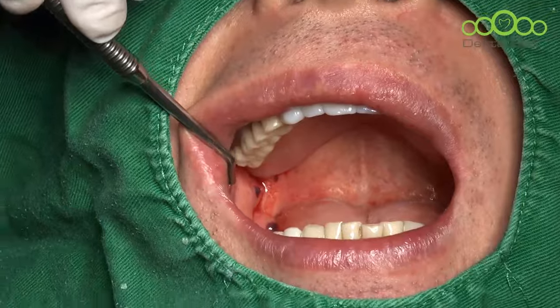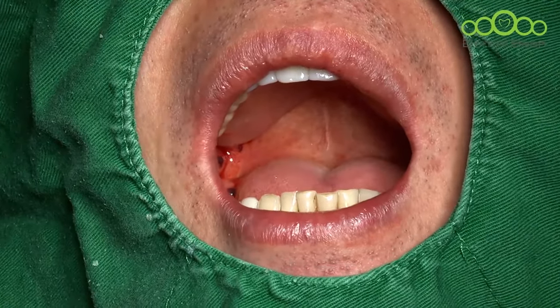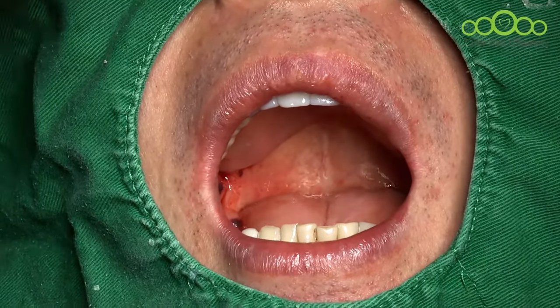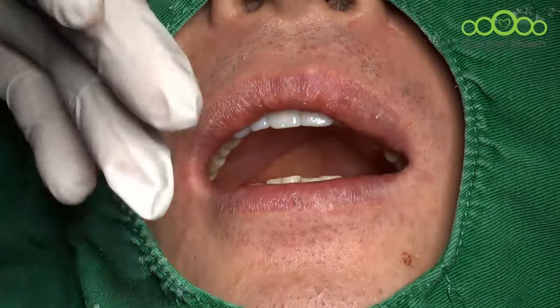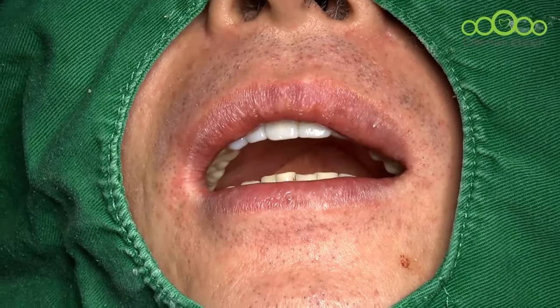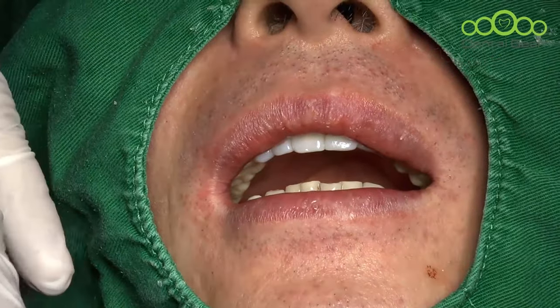And if necessary, you can adjust the occlusion a little bit. And then I want to recommend again, please exchange this soft liner every 2 weeks. How should the soft liner be exchanged with a new one? To protect the implant site and bone graft site, we know where is the weakest area. Please bear in mind.